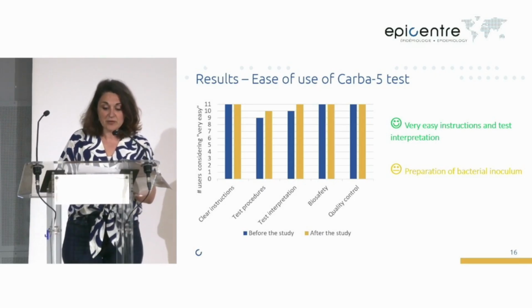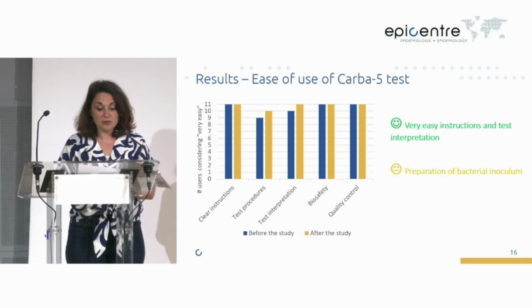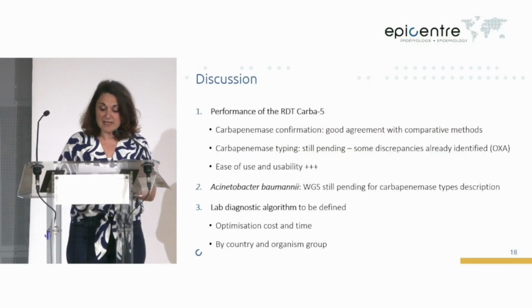The ease of use, before and after the study, the lab technicians tell us it's easy to use, easy to interpret. However, the preparation of the bacterial inoculum is perceived as quite tricky, and the CIM method was perceived as difficult for interpretation, for implementation. You have to wait for 4 hours to read the results, and therefore it might not be easy to fit in the routine work of the lab.